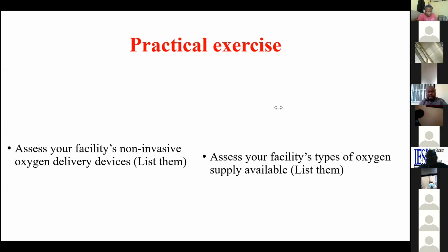I think we have a question in the chat before you share the experience. You have to make some comment on it. I would like to ask about the non-rebreather mask. Some people in COVID-19 used to cover the expiration valves, which are located on two sides of the mask, saying it prevents wastage of oxygen delivery.